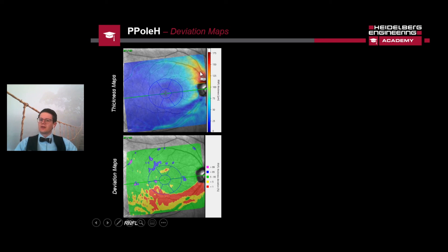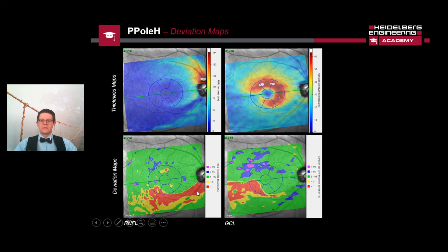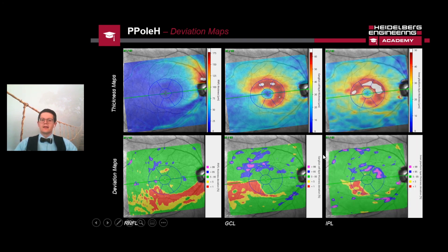Looking more closely at the deviation map, the thickness of the superior nerve fiber bundle is fairly okay in one position, but we can see the darker blue nerve fiber bundle defect in the thickness map, and the nerve fiber layer in the deviation map is way outside normal limits. The same findings appear in the ganglion cell layer — the abnormal position is clearly visible in both thickness and deviation maps. Checking the inner plexiform layer shows very similar findings, with a loss of inner plexiform layer already visible in the temporal inferior part.